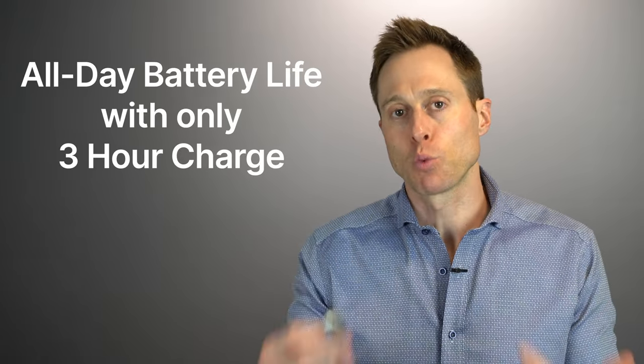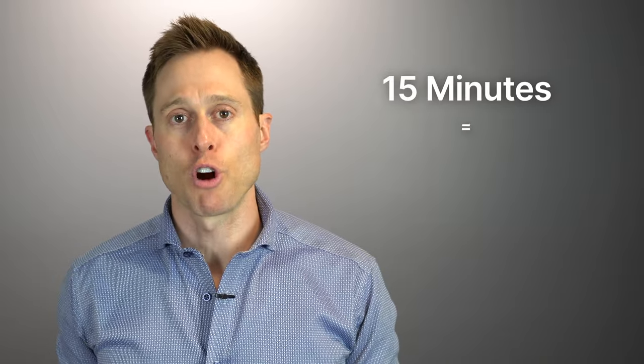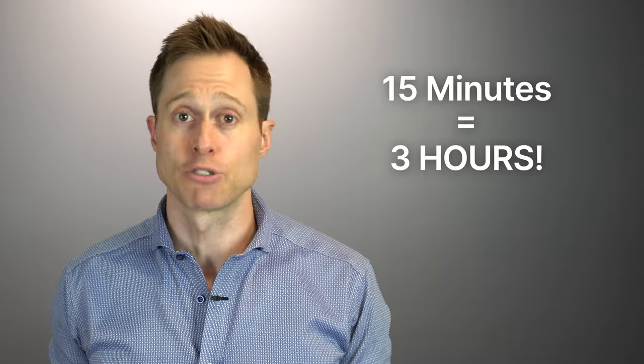Now that you have an idea of what these devices look like, let's start by talking about the Naida Lumity PR. These are the rechargeable version, and you will get all day's worth of battery life on a single three-hour charge. Keep in mind that if you do a lot of streaming from your smartphone or tablet, it will reduce battery life throughout the day and you may have to pop it back in the charger. Fortunately, just 15 minutes in the charger can get you about three hours of additional battery life.